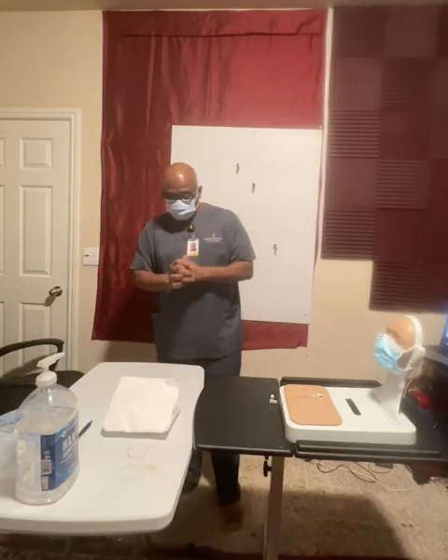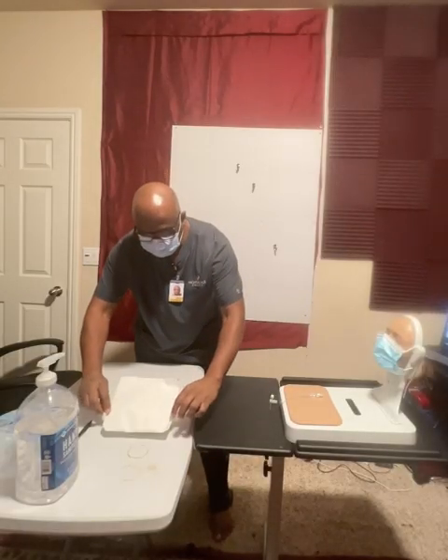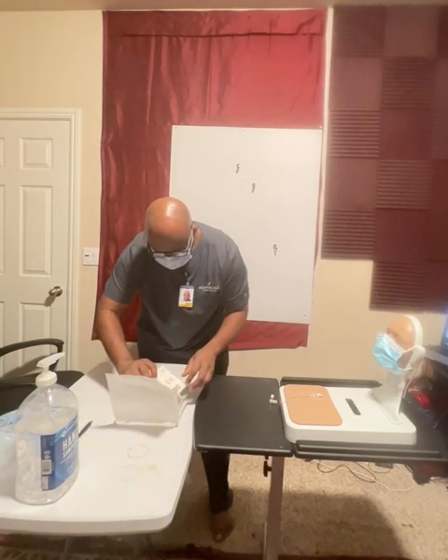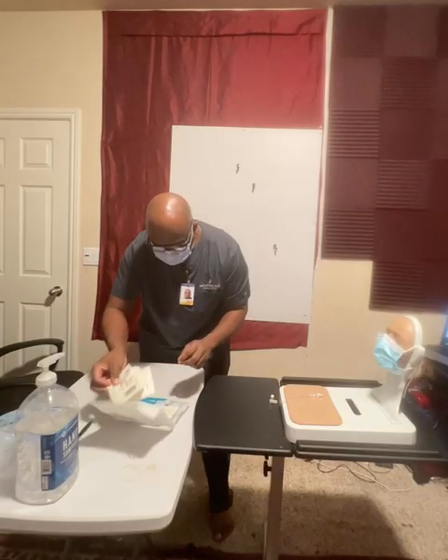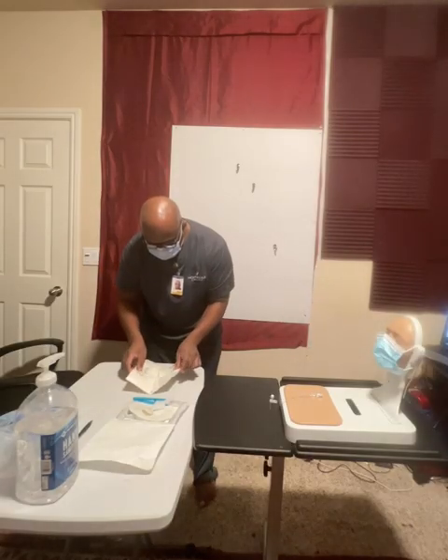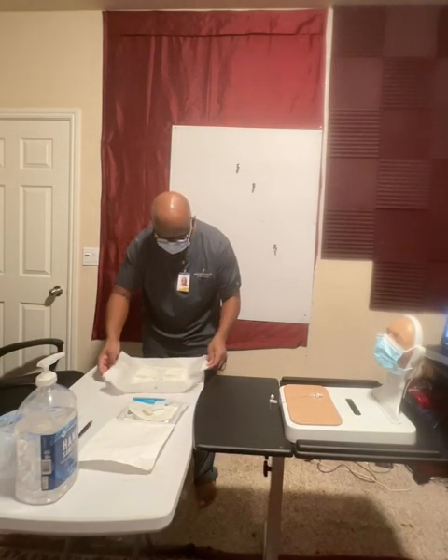Now, I'm going to open up my central line dressing kit. This is the sterile technique we're going to be using. We're going to open this up, make sure it stays open, right? I'm going to only take the gloves out, the sterile gloves. Just make sure that stays open. It keeps coming back, but okay, good. We're going to open the gloves up. Put those on the table. We're going to use the 1-inch border. We're going to pull these apart.